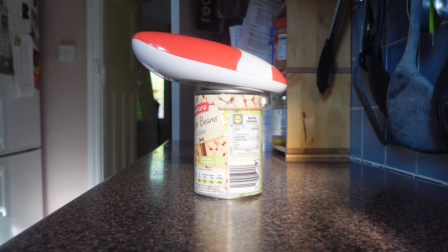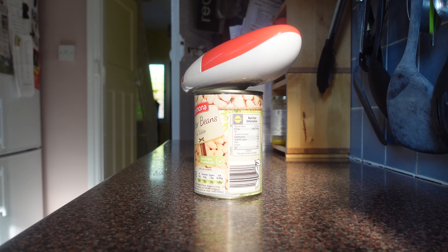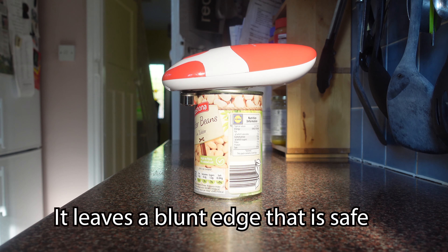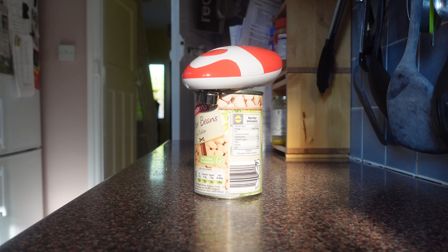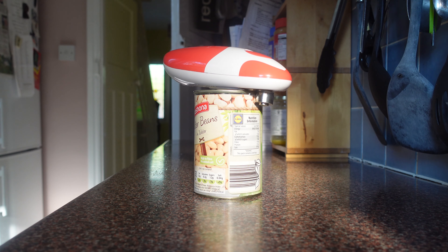Another gadget which I mentioned in my first hemiplegia video is a one-handed tin opener, which is really good. You just place the opener on top of the tin, press the button and it does the work for you. Once it is cut all the way around the tin, you press the button again and it's all done.